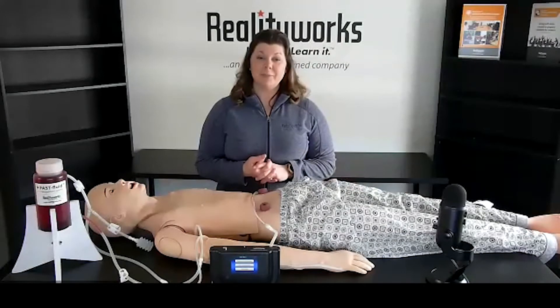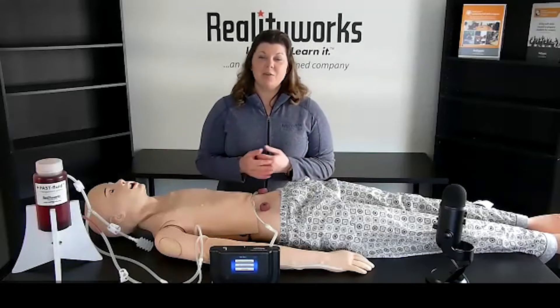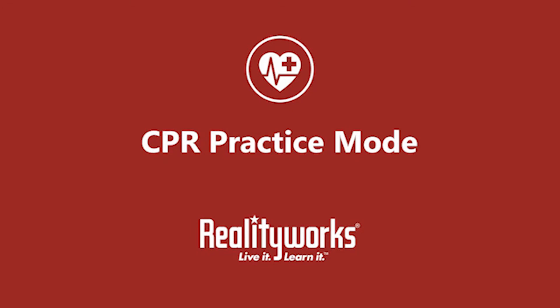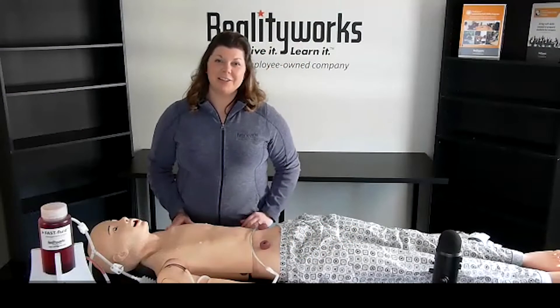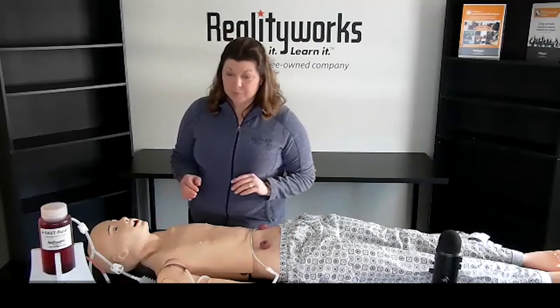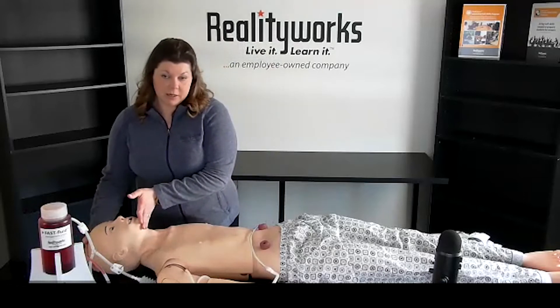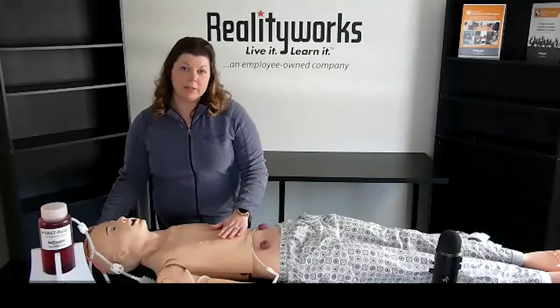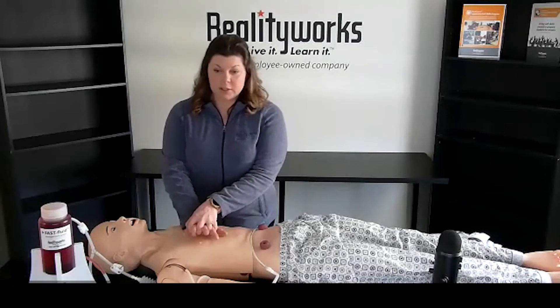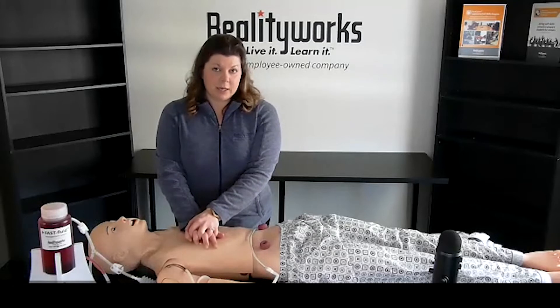Today I'll be going over CPR and the controller, IV insertions with our fast fluid management system, and also ostomy care. Now I'm going to explain how to do CPR on our adult nursing mannequin. Some of the features the mannequin has is that the chin is able to tilt back for a jaw lift, and also when you take breaths the chest will rise and fall. When doing compressions you'll have the opportunity to look at the monitor and see if you are doing correct rate or correct depth.